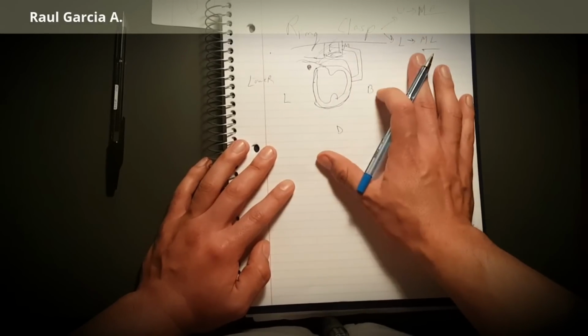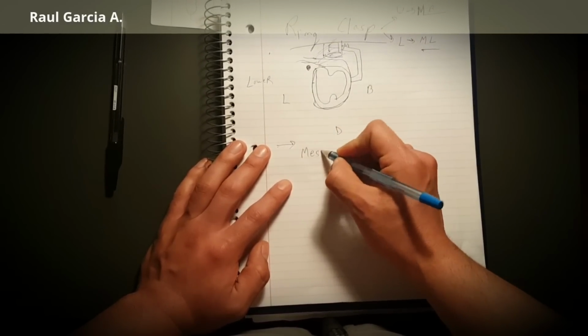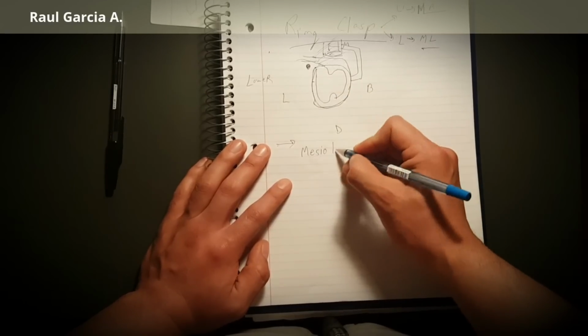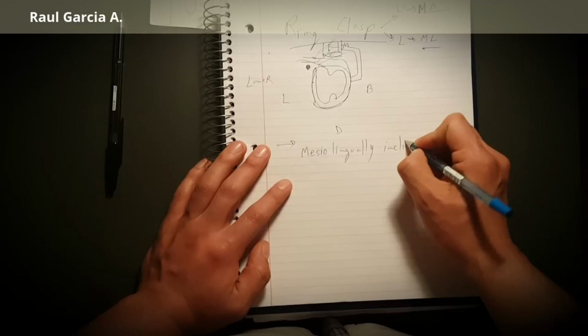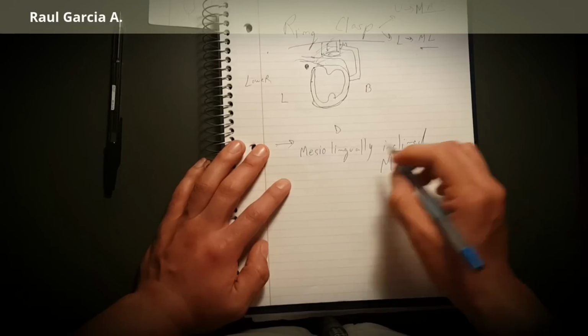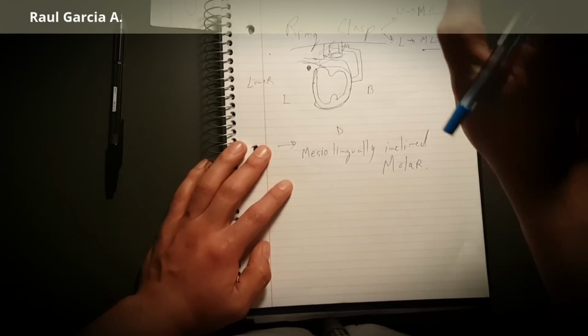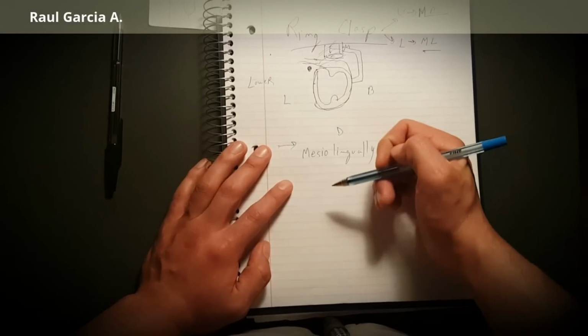Usually if the case demands, we're going to have a mesially lingually inclined molar. Now we have a mesial lingual inclined molar, and we have the undercut in the mesial lingual.